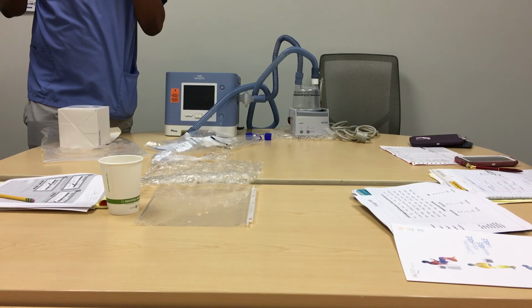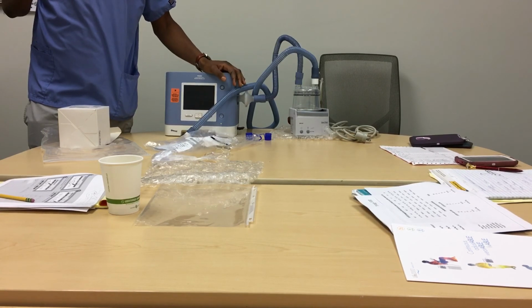Well, nothing works for everybody. It puts them at risk. You would have to determine how they do and then calculate it, and see how long you are going to be gone. Okay, you need 3 tanks. So again, it's not for all patients. If you ask me, it's for the advanced COPDers.